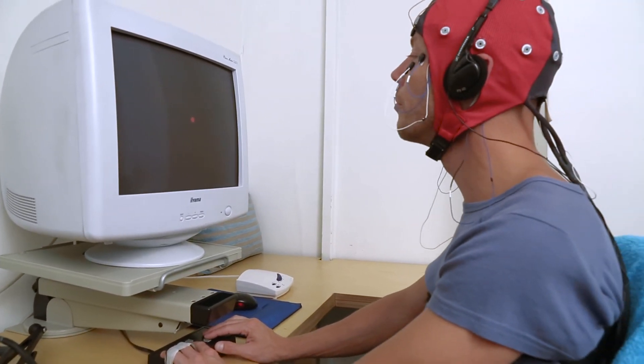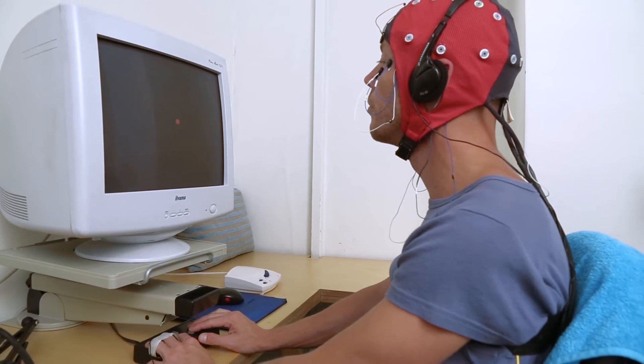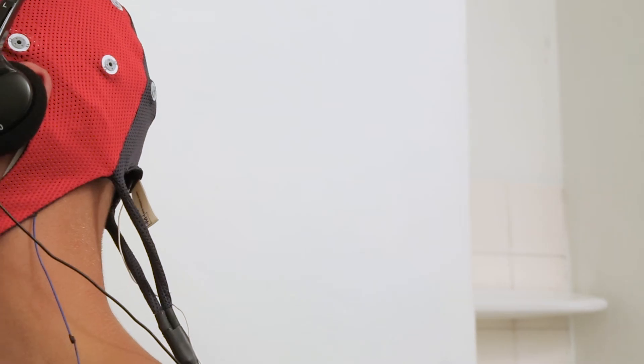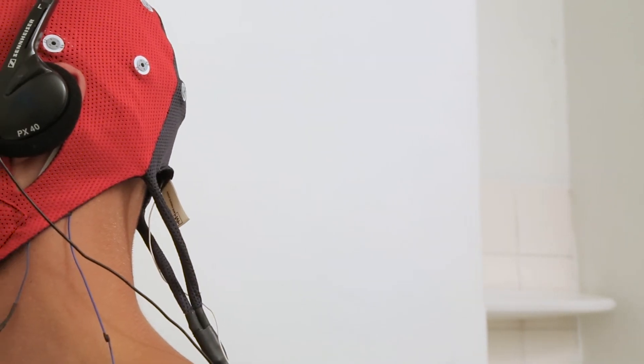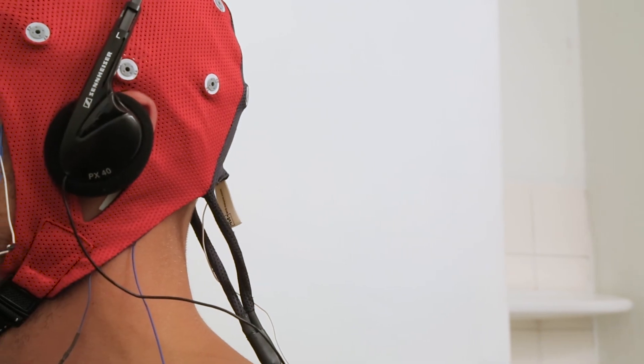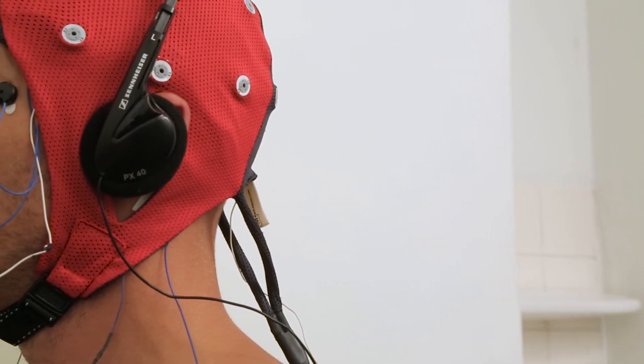During the assessment, it is very important that the client remain relaxed and comfortable. Muscle activity and stress can interfere with the EEG signal.